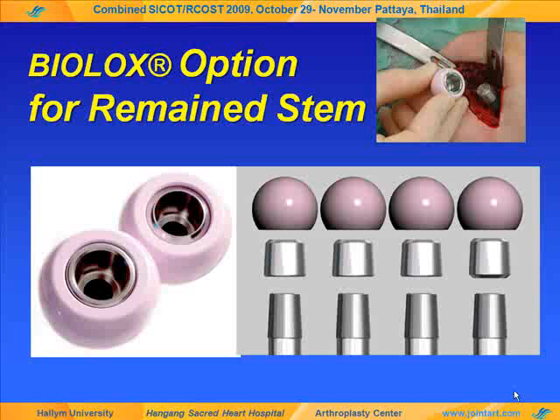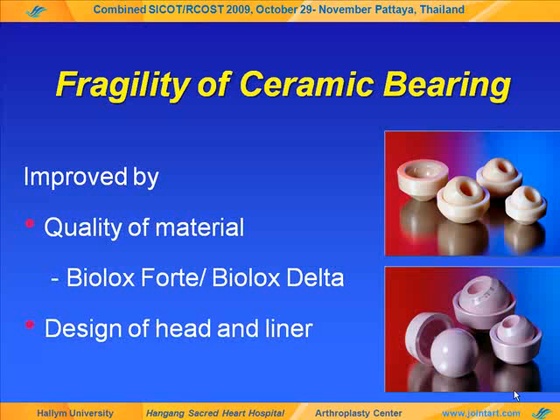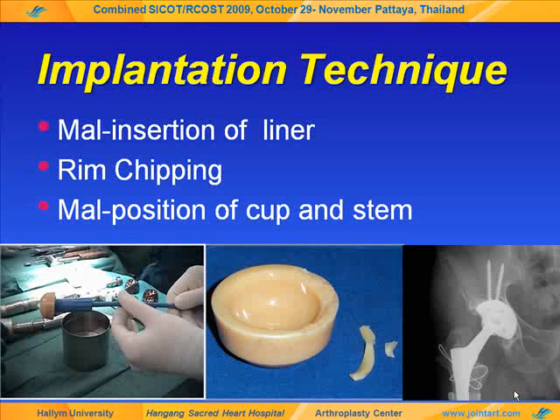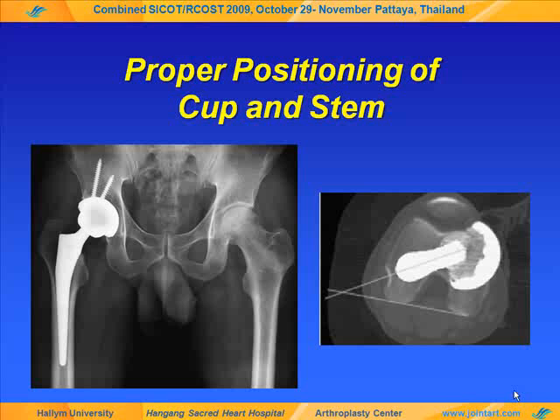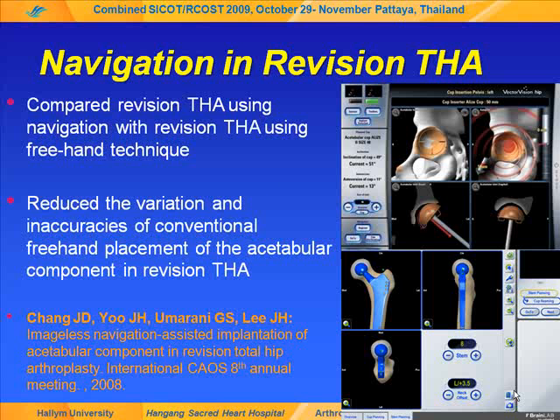The patients who require revision in Korea like this are still relatively young, therefore the bearing surface for revision should be as important as in primary total arthroplasty. In ceramic bearing for revision, fragility is one of the concerns as in primary. Recently improved quality and design of ceramic bearing have reduced these concerns. Implantation technique is also important to reduce complications. Proper positioning of cup and stem is essential for prevention of impingement. The concept of combined anteversion and navigation-assisted implantation could be helpful for exact positioning.